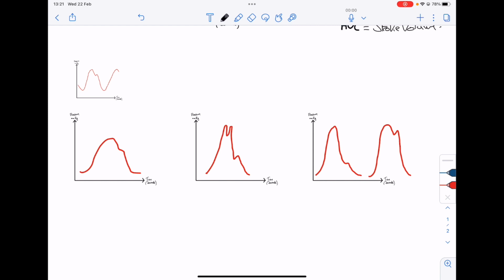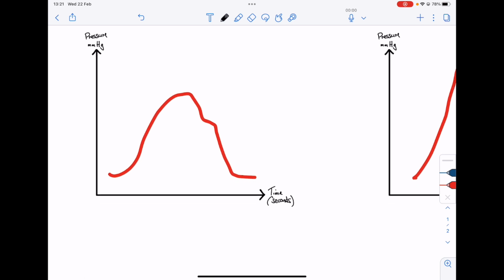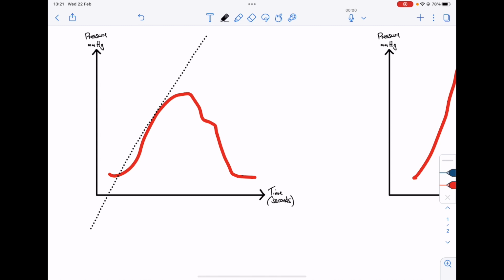So you can either learn them by rote, or you can work to try and figure it out as you go based on common sense. So common sense, our first one, we know that the gradient up is poor, so the gradient that way is pretty non-steep, and equally it's got quite a rounded top.